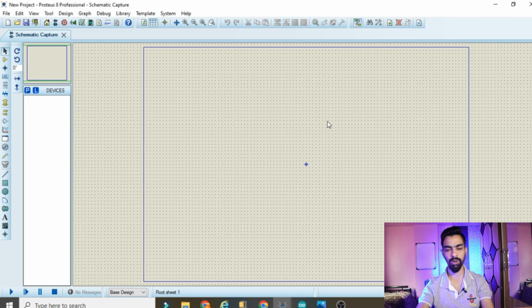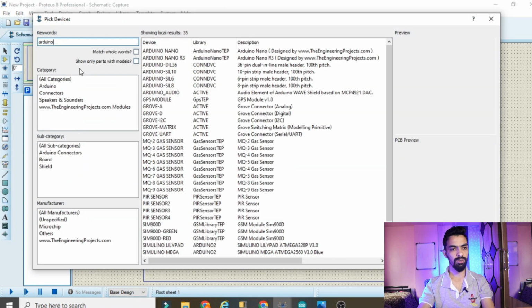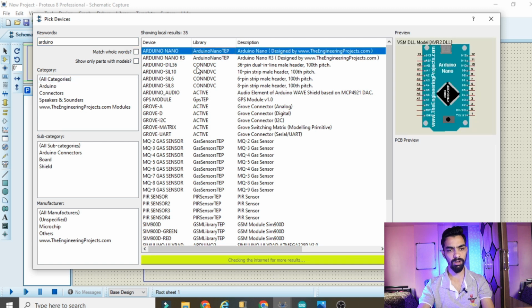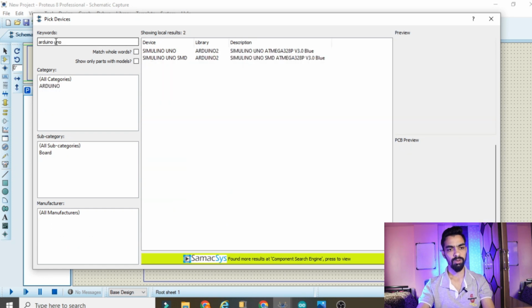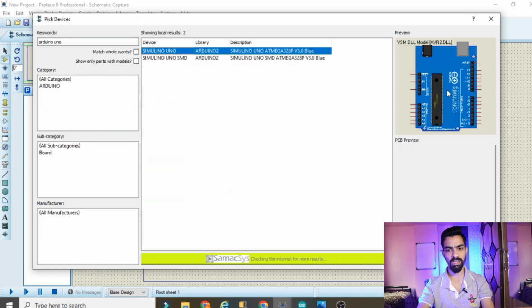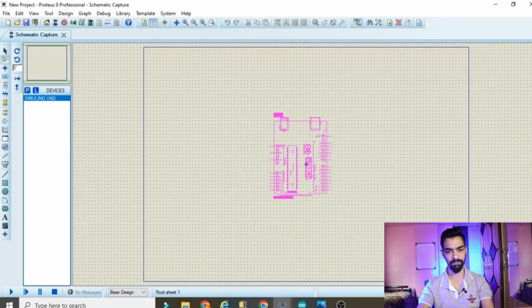The first part is we have to load the Arduino here. So go to the component mode at this side, then click on P and type here Arduino. Once you type Arduino, you can see the Arduino library will open. We have to select the Arduino Uno. So type Arduino Uno, select this Arduino Uno, click on OK and place that Arduino Uno here.